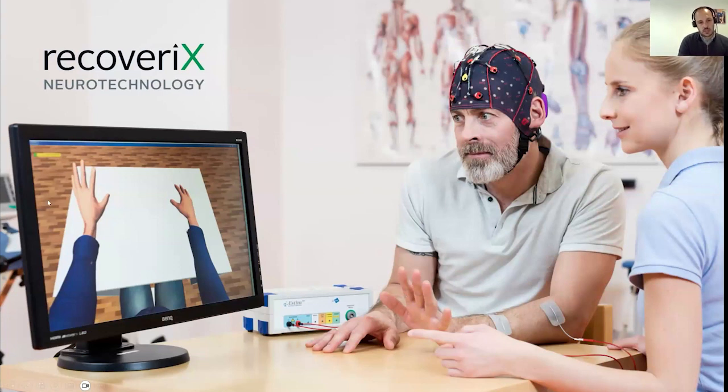The patient is looking at the monitor, where we have an avatar that moves the hands in real time, linked to the patient's EEG activity. And then we have a functional electrical stimulator. This also is not accurate, because the real system has two electrical stimulators connected to each forearm, or one to an arm and the other to the leg. The patient also uses these electrodes attached to the forearm to receive the stimulation. But more or less, the idea of the system is this one.